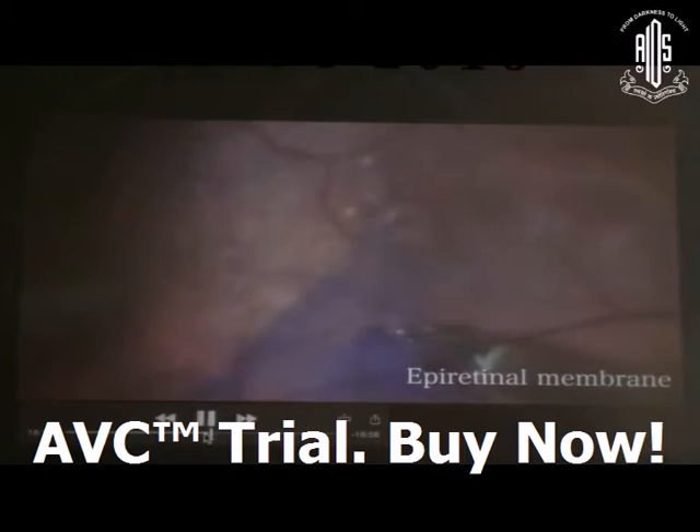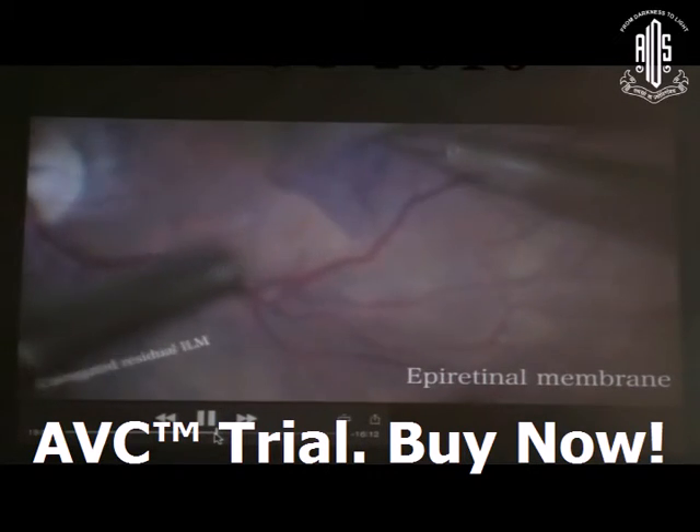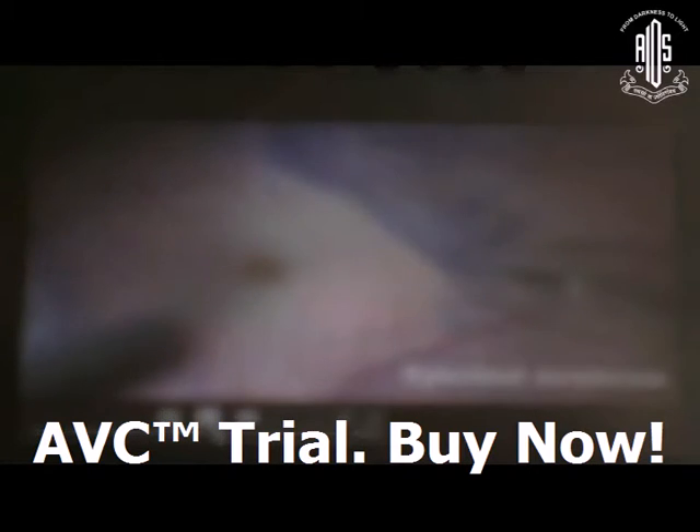Sometimes while peeling the ERM, the underlying ILM can also be peeled because it is very tightly adhered to the ERM. Recheck with brilliant blue G dye, and then the residual ILM part must be removed — I stained the ILM with BBG dye and removed it to prevent recurrence of ERM formation.